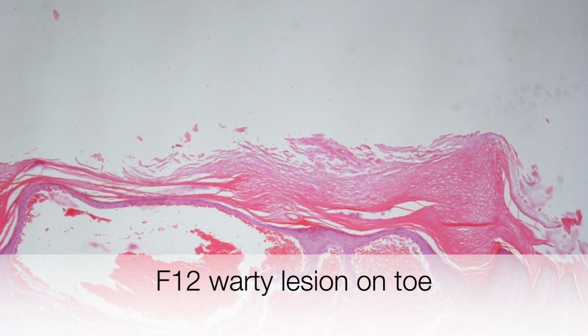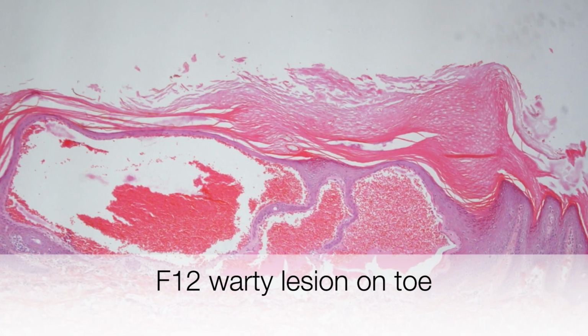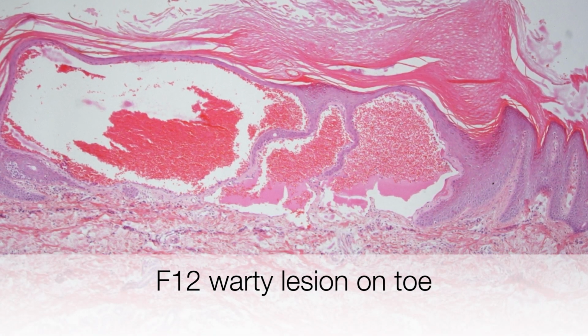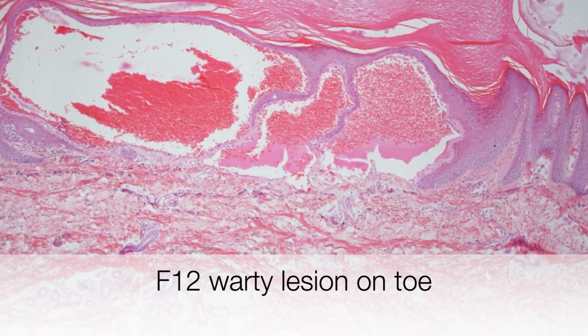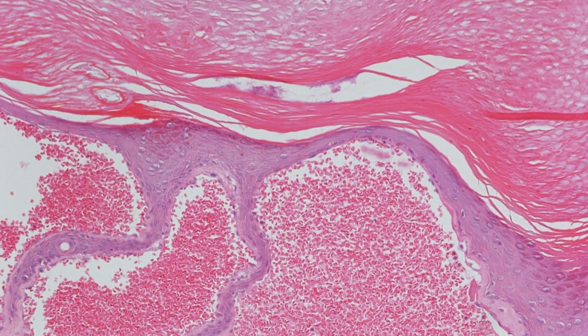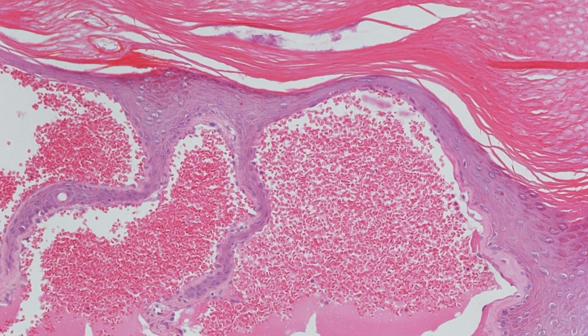Case number 4 is a female of 12 with a warty lesion on the toe. What is it? Here is a higher power view.